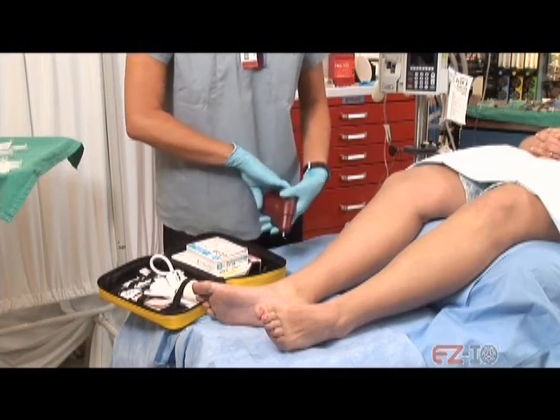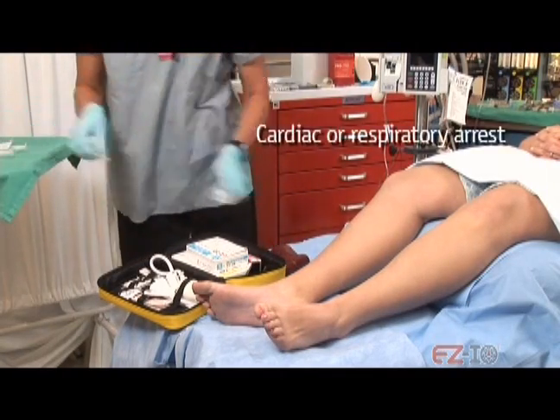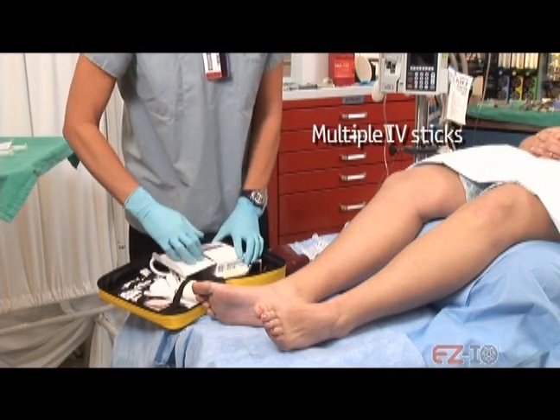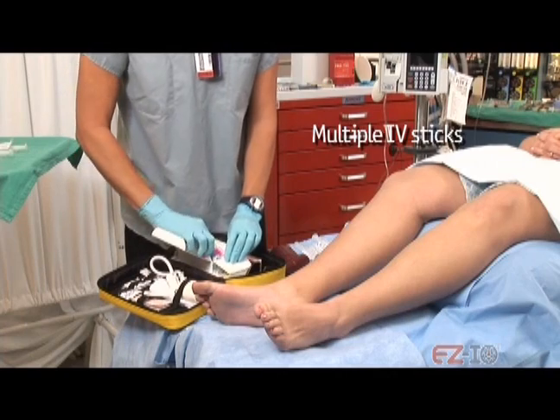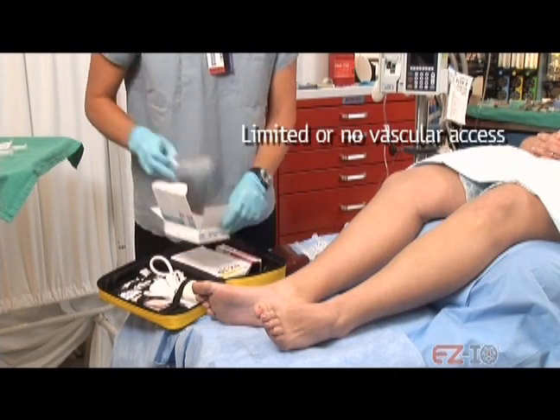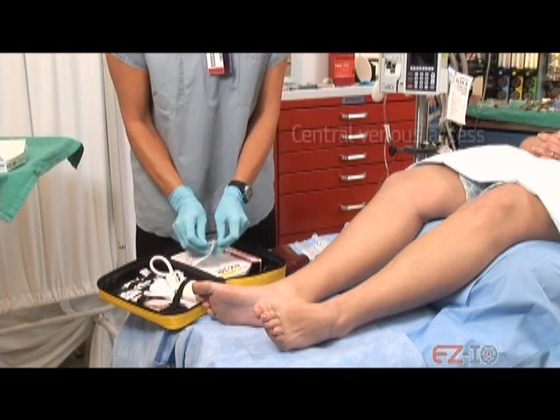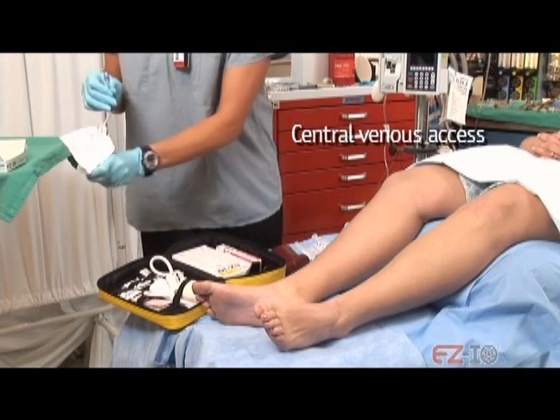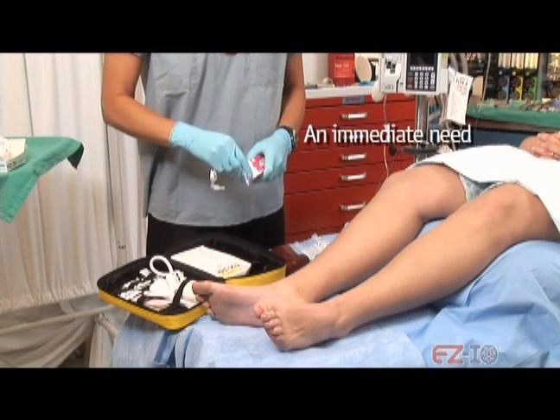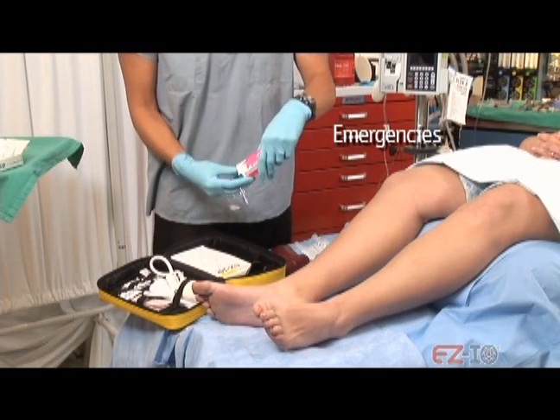Who needs an IO? IO is indicated for acute patients who are experiencing cardiac or respiratory arrest, require multiple IV sticks to obtain vascular access for medication or fluid infusion, have limited or no vascular access, require rapid intubation or sedation, previously have required central venous access for infusion due to difficult vascular access, have an immediate need for drugs or fluids, or require intraosseous access for emergencies.